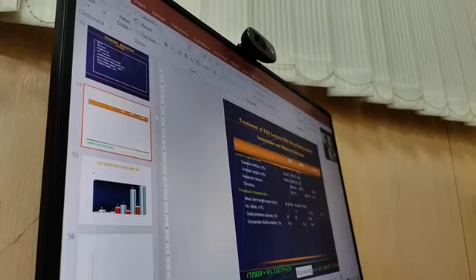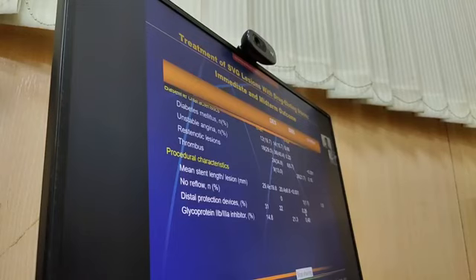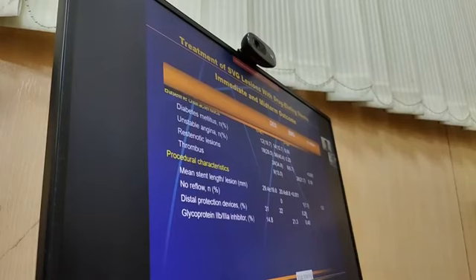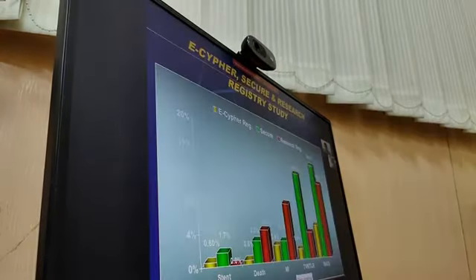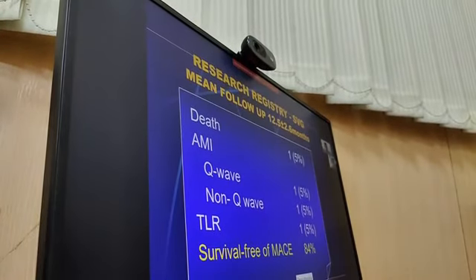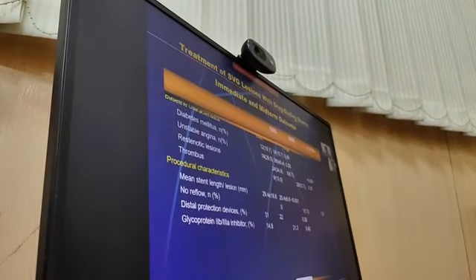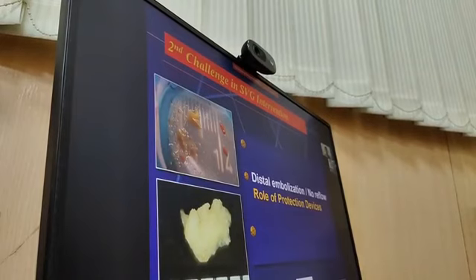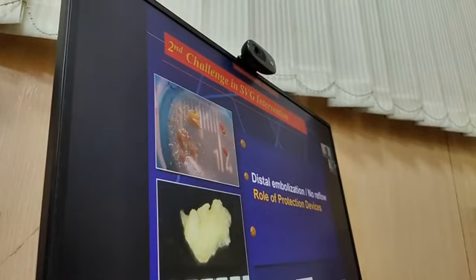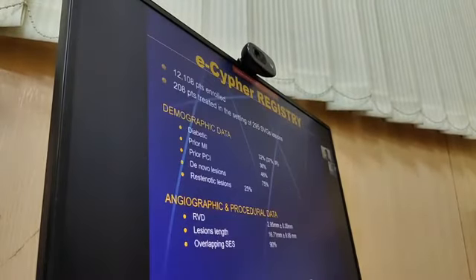No. Obviously, we will always use drug-eluting stents because they are much more easily available these days. Bare metal stents are very rarely used, if at all. Rather, I would say absolutely not used. So this comparison is only for theoretical purposes. First, they showed the superiority of stents in the first slide, and then the superiority of drug-eluting stents over bare metal stents in prevention of restenosis. So stents have to be used always. This was when there was a lot of cost difference and they were very expensive, 1,25,000, versus 30,000-40,000.